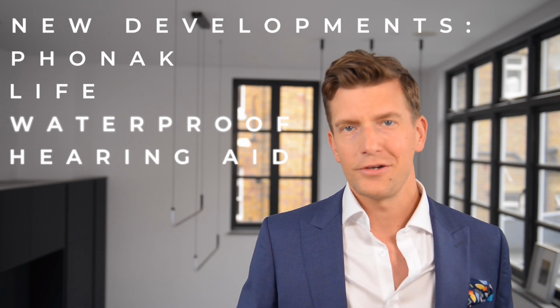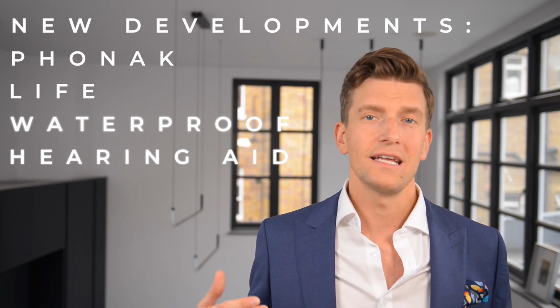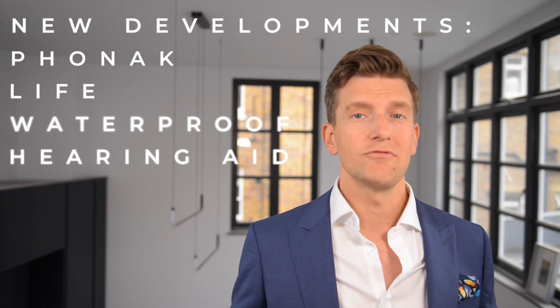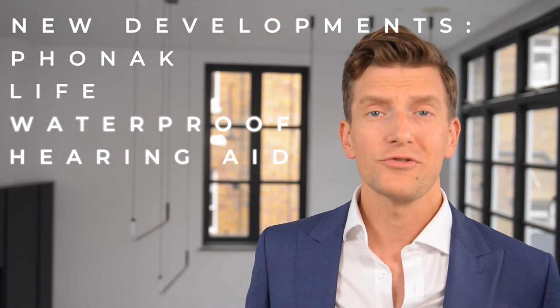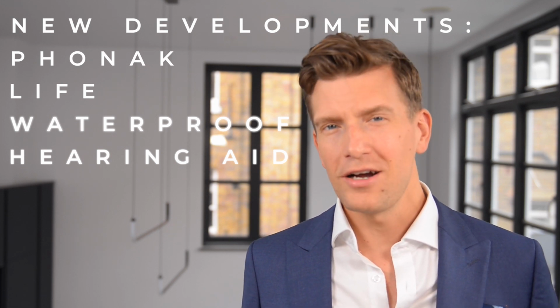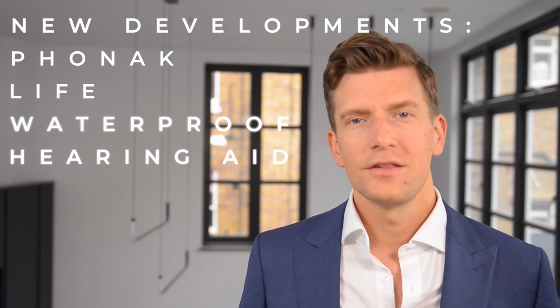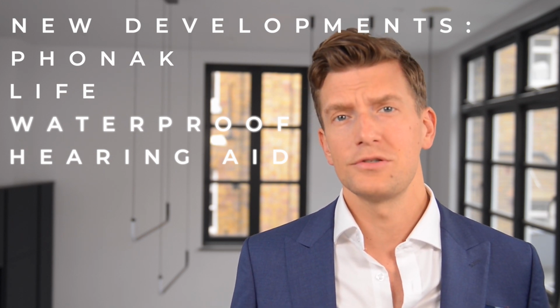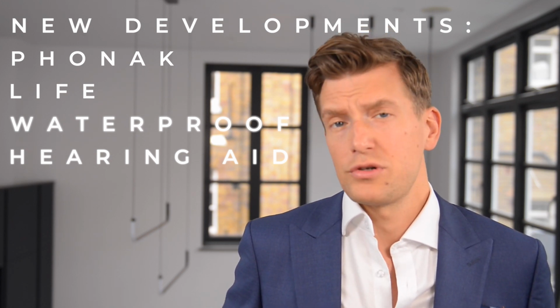They're not the first manufacturers to do this though. So about 10 years ago, ReSound were boasting it using a nano coating technology, but they are the first manufacturers to do it on a fully rechargeable set of hearing aids. If you're wondering why this is a big deal, well, it kind of is and it isn't at the same time. The hearing aids themselves are still on the Paradise range, so if you're a current Paradise user, I honestly wouldn't bother changing or considering them.